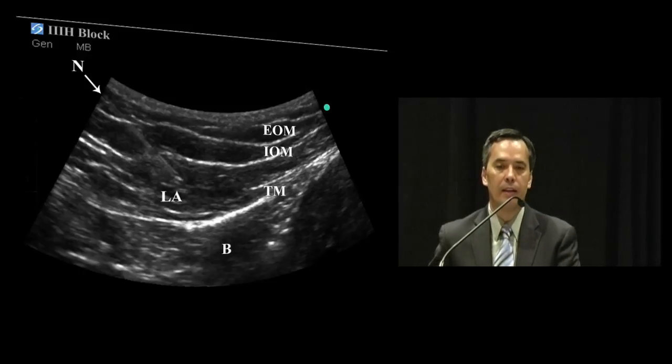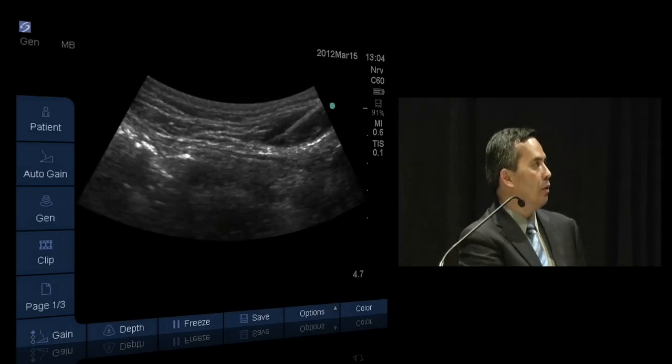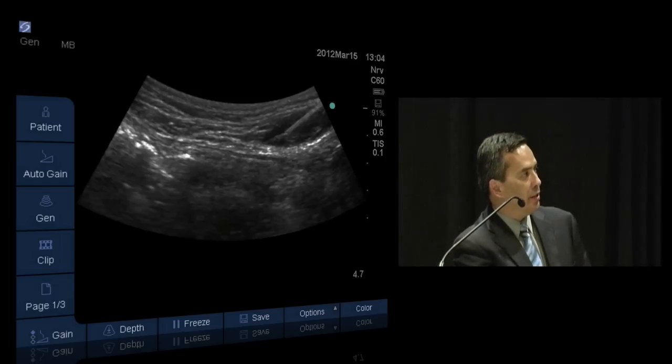the local anesthetic. And this is showing some local anesthetic. This was a thinner patient, but see, here's bowel here, so definitely stay away. Stay up in this area.